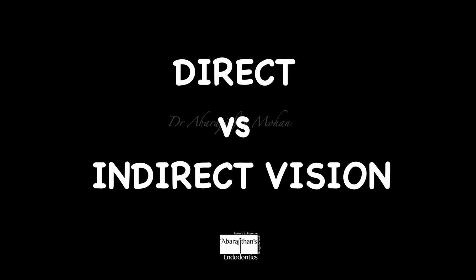Now we'll discuss direct and indirect vision. There is a common myth that when people use a microscope, every procedure has to be done only with indirect vision. I myself was told so, and in the beginning it was a little tough for me to crack this. And now I'm going to tell you what are the procedures that you can do with direct vision under microscope and what are the procedures that you can do with indirect vision with a microscope or a loupe.